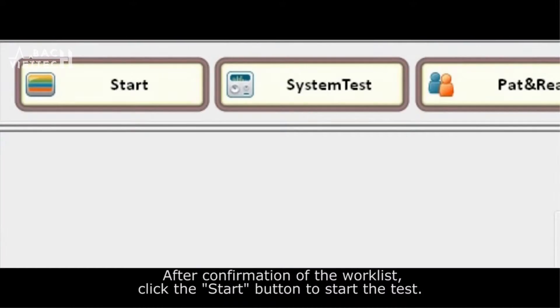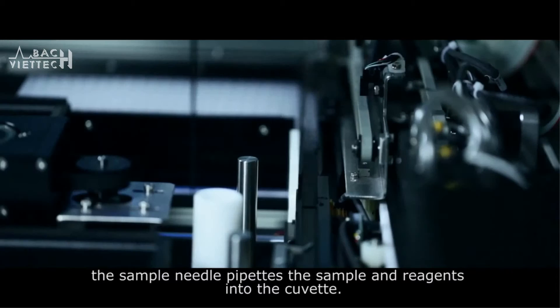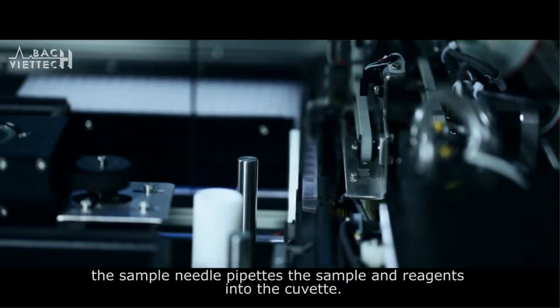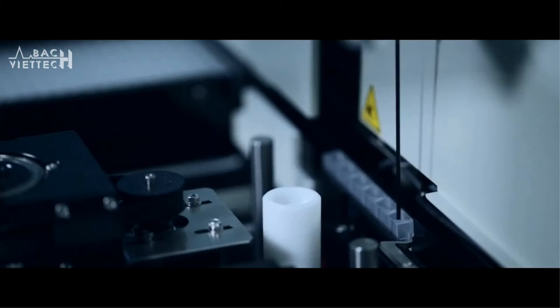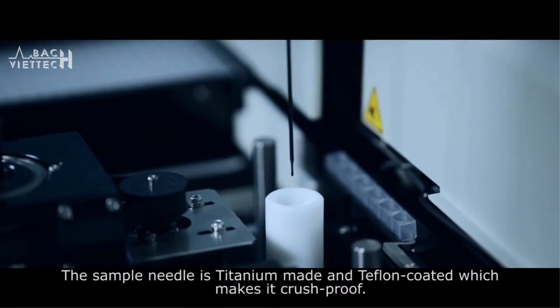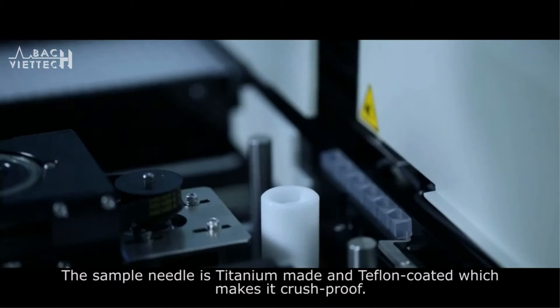After confirmation of the work list, click the Start button to begin the test. As the test commences, the sample needle pipettes the sample and reagents into the cuvette. The sample needle is titanium-made and teflon-coated, which makes it crush-proof.